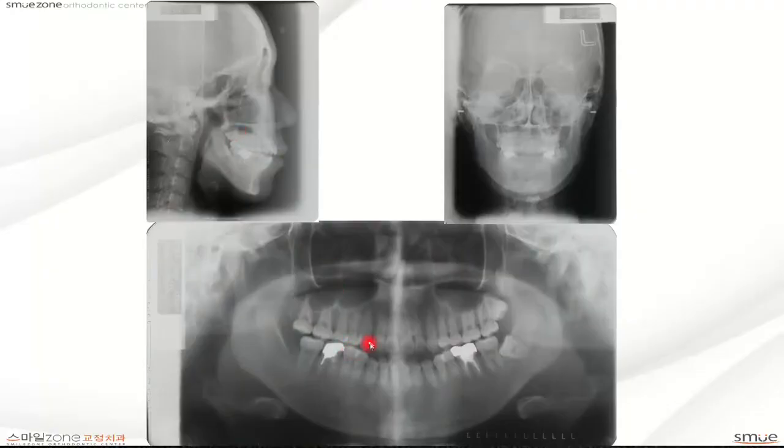But here, somebody asked me yesterday if I have a sinus invasion when I place a mini screw. In this case, it's a little bit difficult because the sinus level is very low to the apical area. But you can see there is some space between the hard palatal bone, the maxillary bone, and the tip of the apex. So I decided to intrude instead of having impaction surgery. So I told her, "Oh, you don't need surgery. I can treat it with the help of the mini screw."